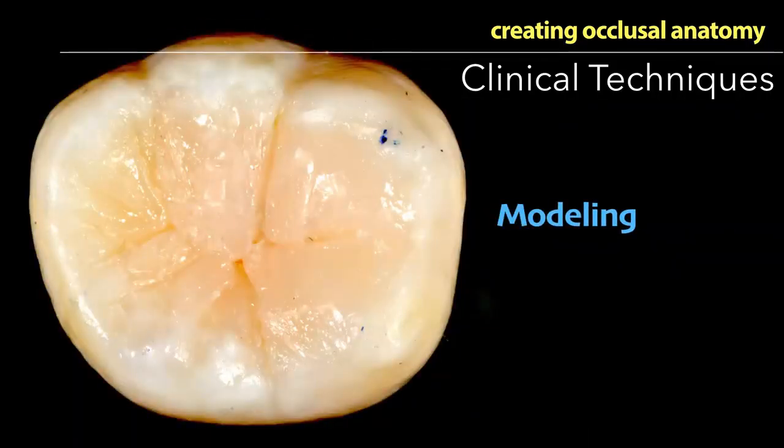Then you complete the modeling. The distal cusp is the easiest and smallest cusp, so you can complete the modeling and then evaluate that there are 5 cusps, and every cusp has the morphology that we studied in our anatomy books. So follow these steps, but after reading the exact morphology and volume of the cusps.